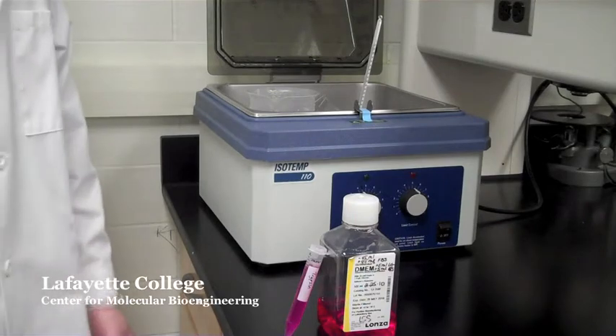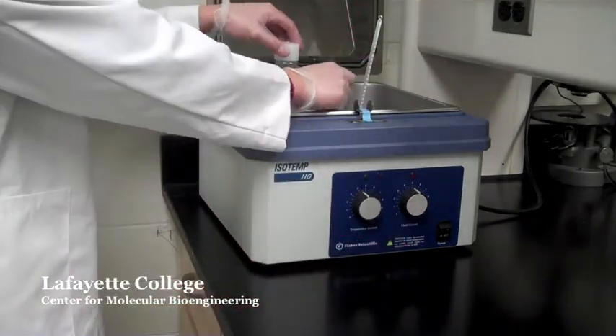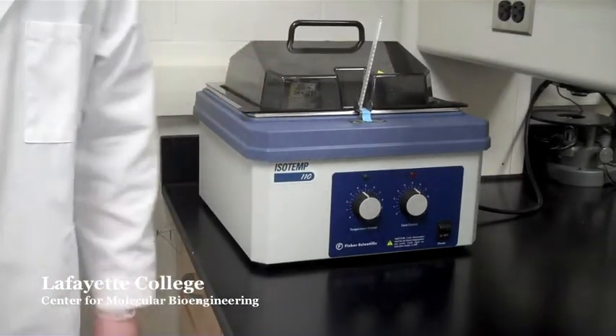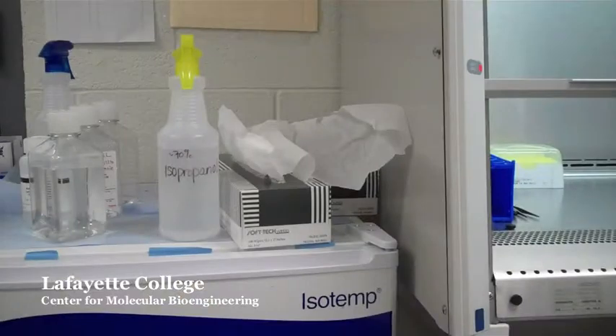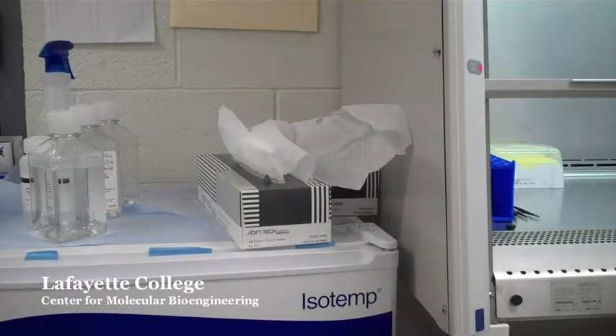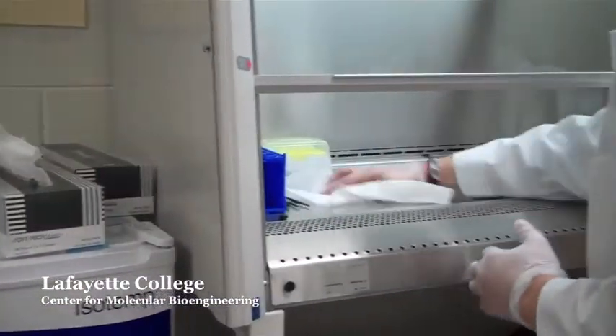To change the media in a T75 flask, begin by placing the appropriate media in the warm water bath at 37 degrees Celsius. This should take about 5 to 10 minutes. Prepare the biosafety cabinet in the same way as described in the changing media tutorial, being sure to remember all aspects of proper sterile technique.